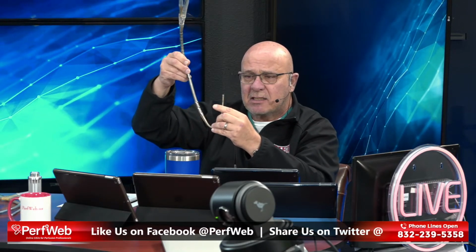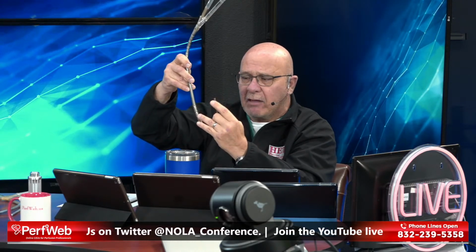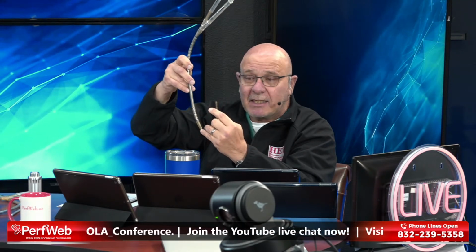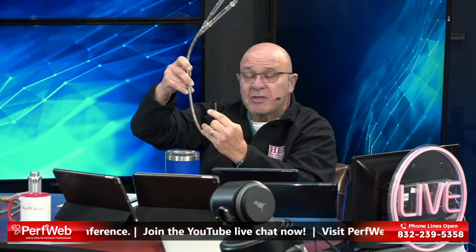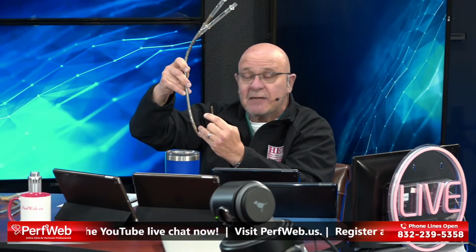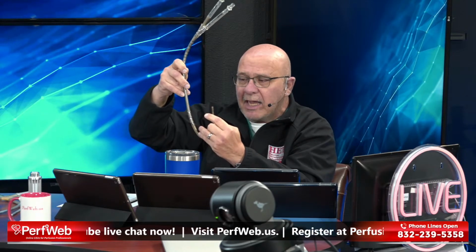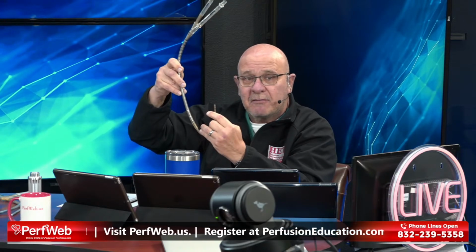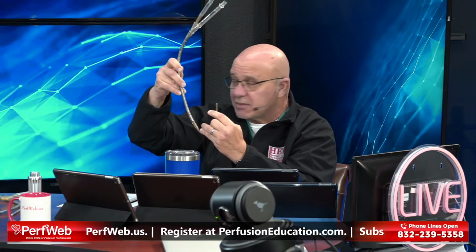So it sits in this configuration, and you have drainage from the right atrium and return to the pulmonary artery past the pulmonary valve. So you can see that would certainly reduce dramatically, if not eliminate, recirculation, but it would also, of course, significantly help a failing right ventricle. So this is an excellent tool for RV dysfunction.